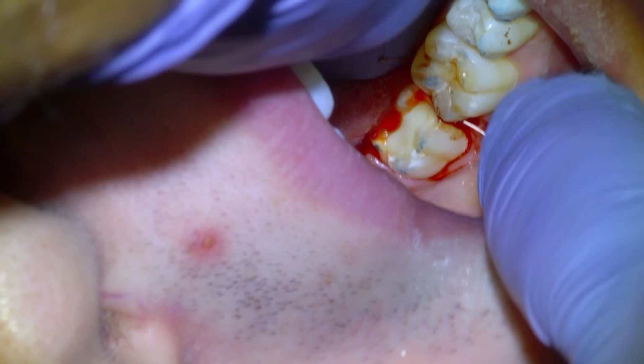Going to check the contact with the floss, and that is a wrap.